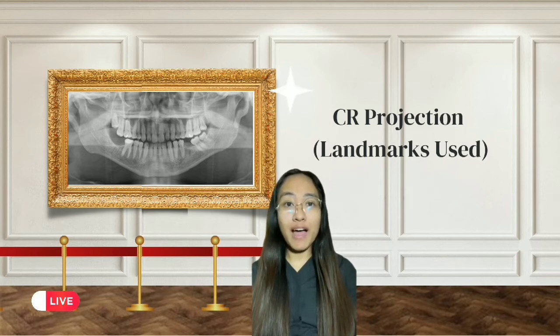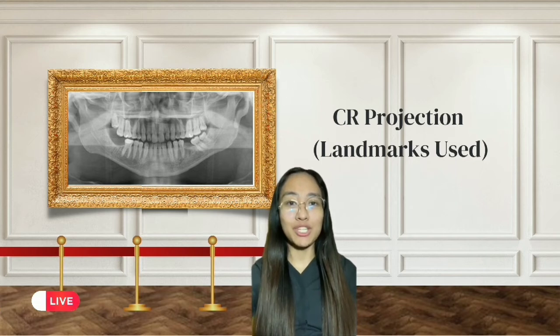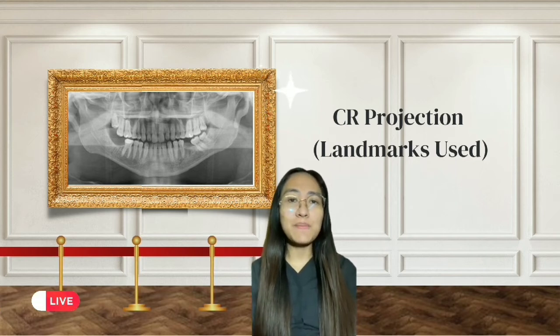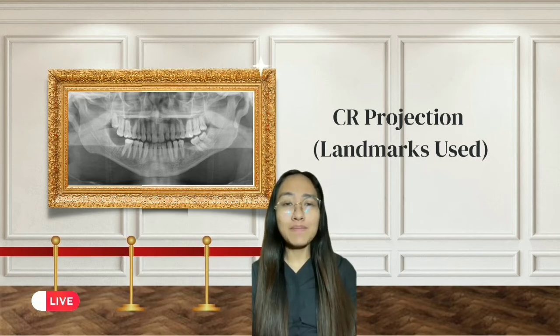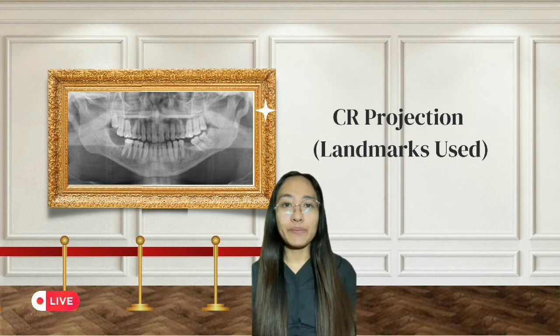So first off, I am going to discuss this image beside me. This is a diagnostic panoramic image. A diagnostic panoramic image results when the equipment preparation, patient preparation, and patient positioning are completed correctly. The ideal panoramic image should be free from all errors in exposure, technique, and positioning.